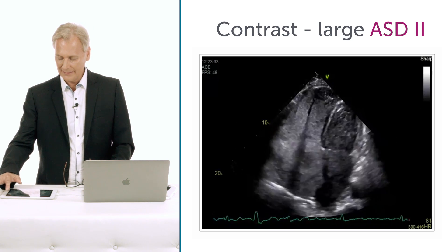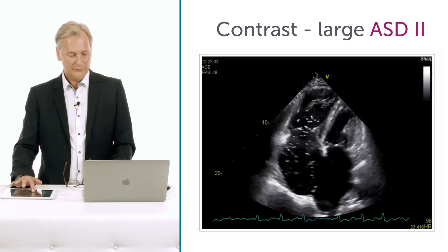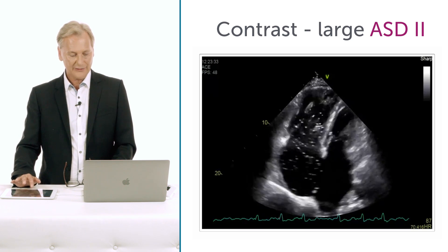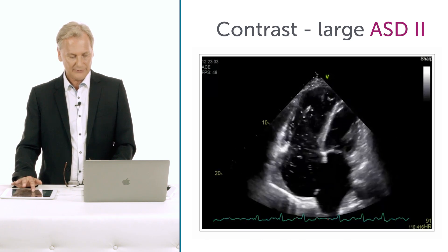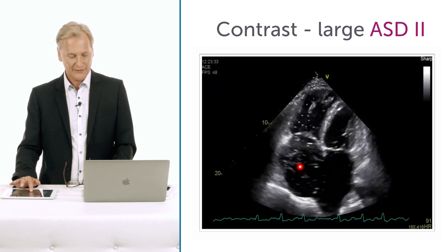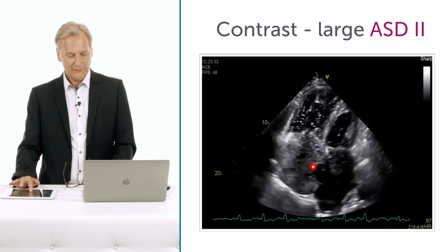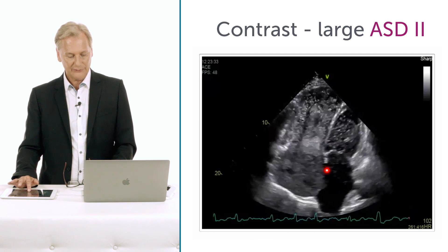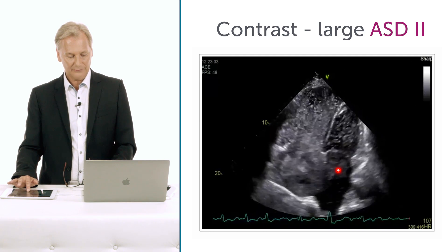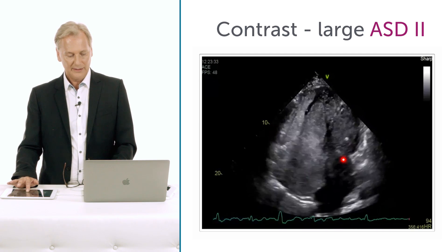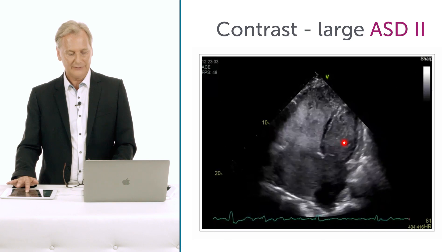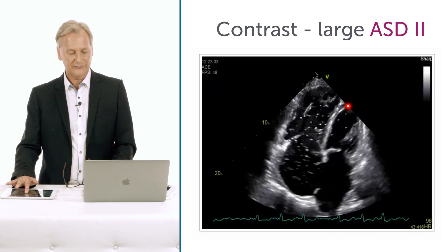What we nicely see here is that there is actually contrast opacification via this atrial septal defect right here, now into the left atrium and into the left ventricle.